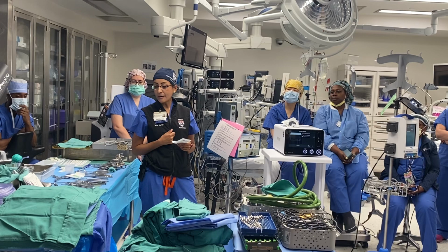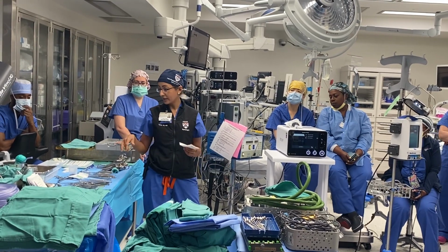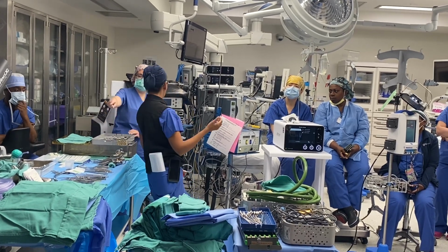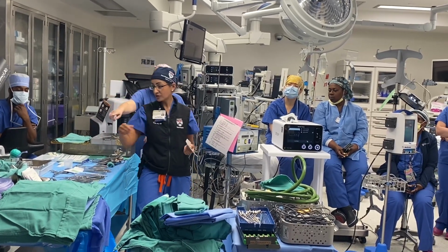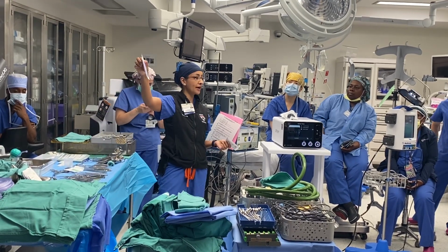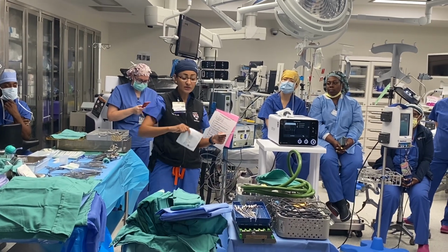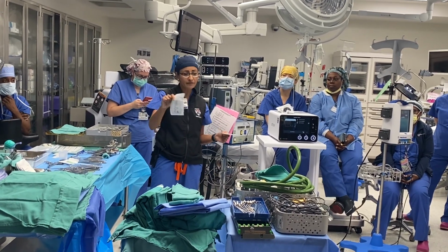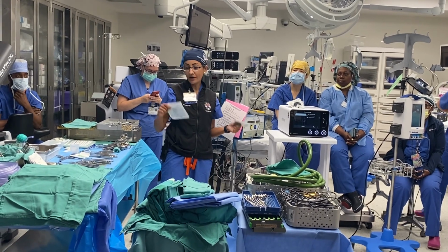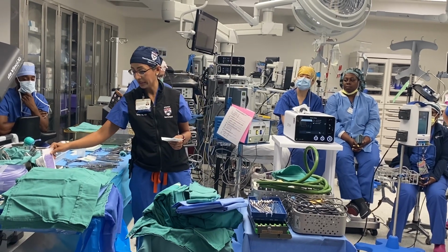And then we close up the galea. The galea usually again with 2-0 pop-offs. We love pop-offs. Those look like these ones, right? We use a ton of these pops to close up that whole scalp, and sometimes we'll leave a drain in there too, and then usually staples for the skin. So that's a subdural hematoma case.